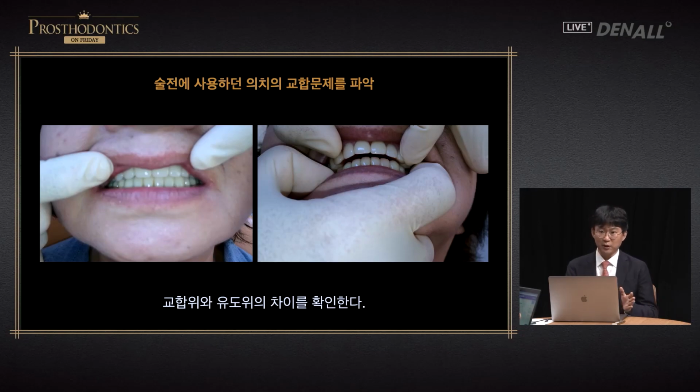So when you fabricate a new denture, you don't just go ahead, but you need to do deprogramming, which I will explain later. If you lead the patient to comfortably bite, you will realize there's a discrepancy between the comfortable biting and the bite in the old denture. If you proceed to the final denture in this situation, later bite taking can be a little bit difficult, and it is important to make sure the patient can chew pretty well with the bite.